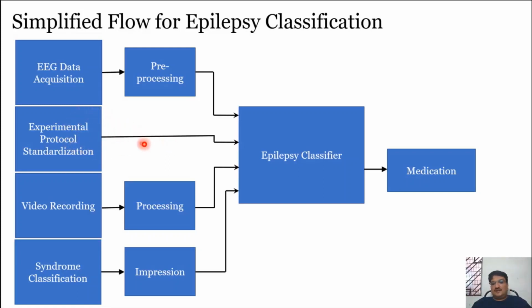Additionally, along with all these details written by a person, in some hospitals or units they will provide video recordings. There will be one constant camera on the face of the person, or it will cover some part of the body. In a way they will observe the movement, and it is for better interpretation of your EEG data. And last but not the least, syndrome. So if you get features, if you say symptoms, all these things.